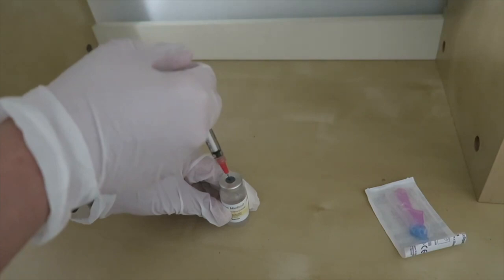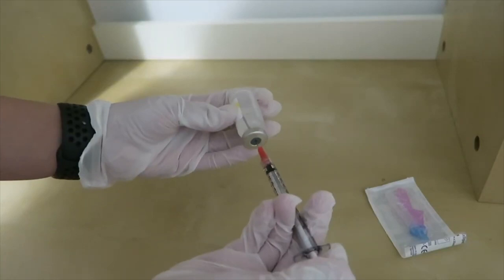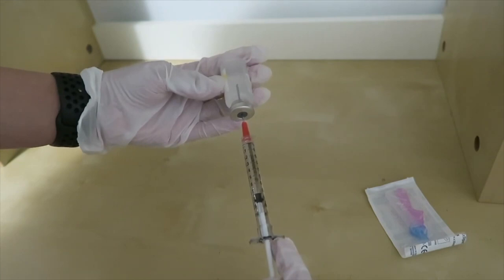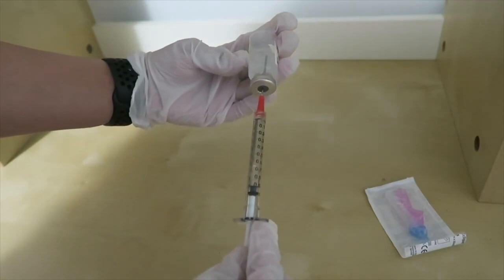Now ensuring that the needle is underneath the surface, I will be drawing up the 1ml of vitamin B12. And while I'm doing so, I'm also reviewing the doctor's order to ensure that I have the right medication and the right amount being drawn up.